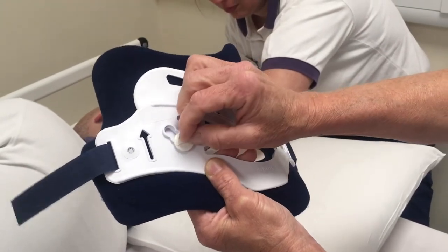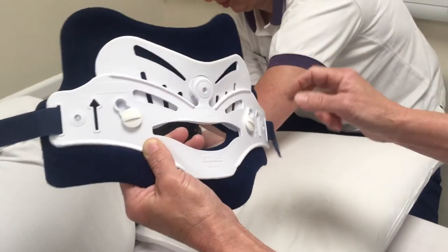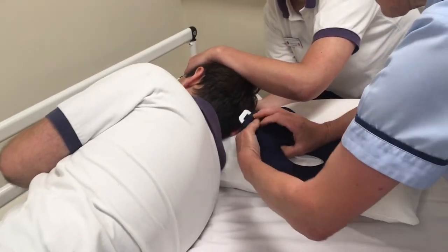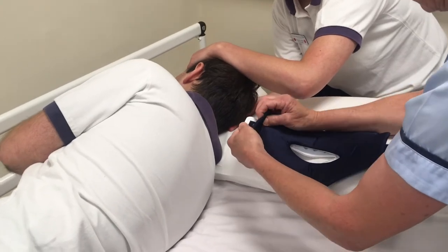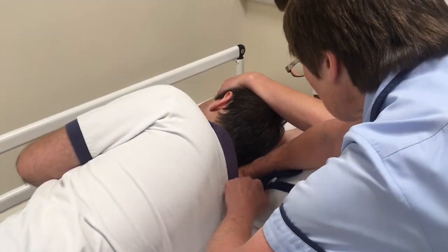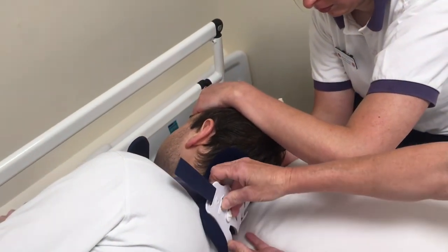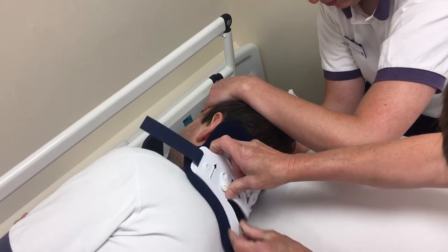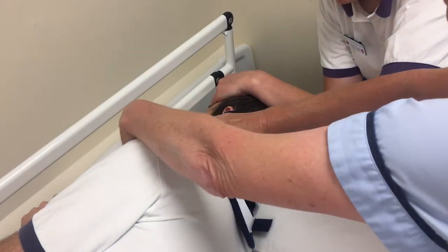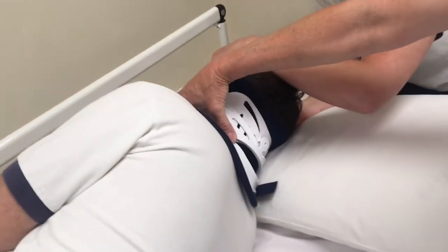When replacing the collar, always make sure that the directional arrows point upwards. Hold the velcro opposite you out of the way, get the collar into position centrally, making sure that it comes adequately down over the shoulder, and lock into place with the velcro strap.